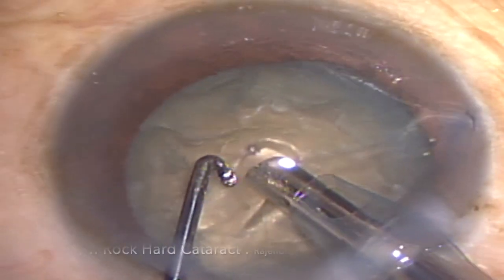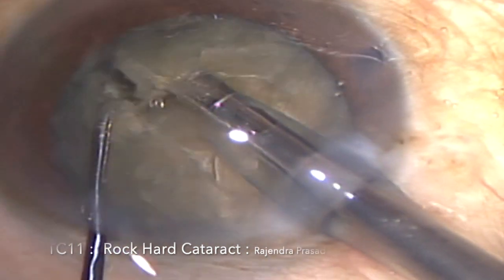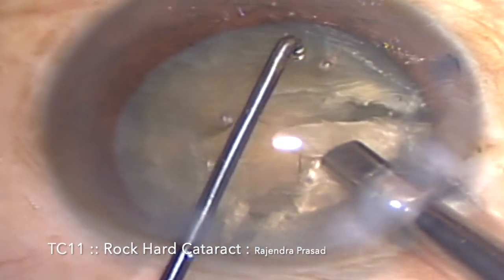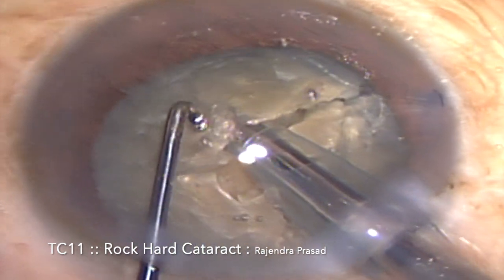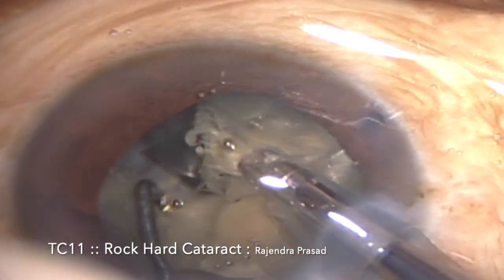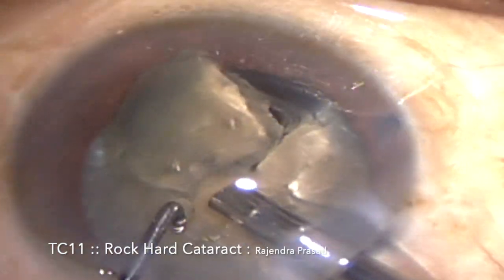I have brought the first hemi-nucleus in front of the FACO probe, again holding the nucleus just within the equator, hooked it and cracked — the first hemi-nucleus is broken into two complete free segments. Now the second hemi-nucleus comes in front of the FACO probe; I held it just within the equator, hooked it and cracked it. You can see the cracking force of this device which cracks the nucleus into two complete free segments.